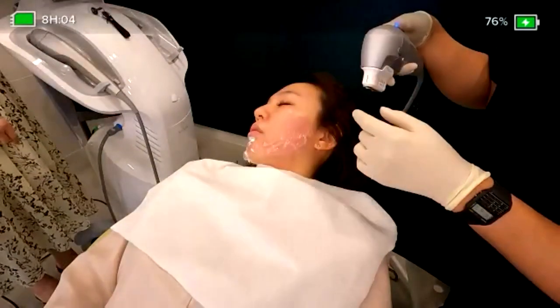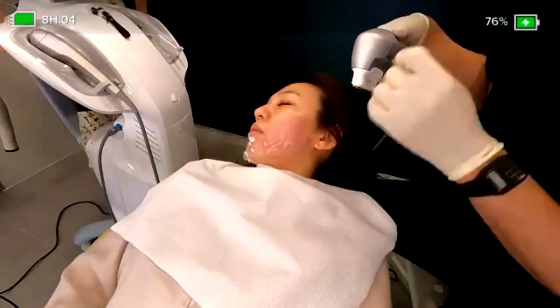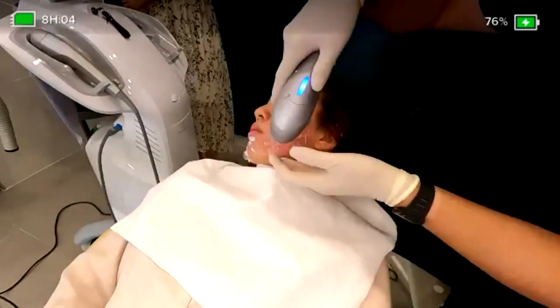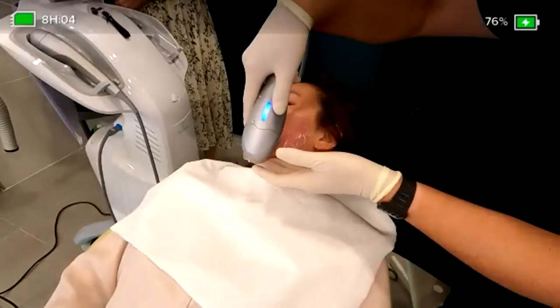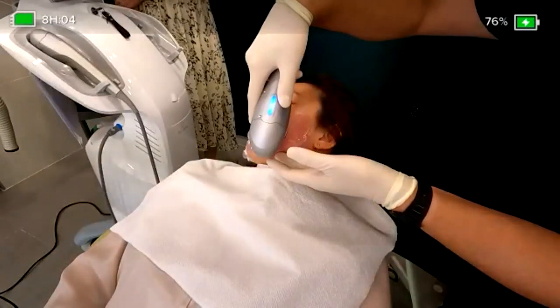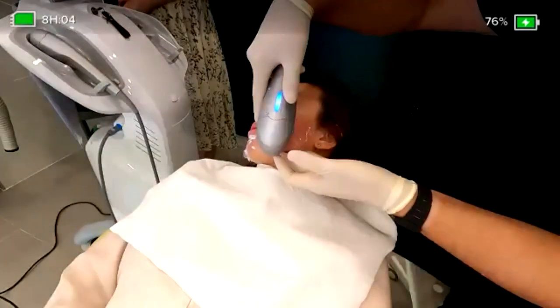Usually this one is pitched 1 to 1.5 millimeters. So if you know how many lines you are taking, we can reversely calculate the portion we treated at the moment.